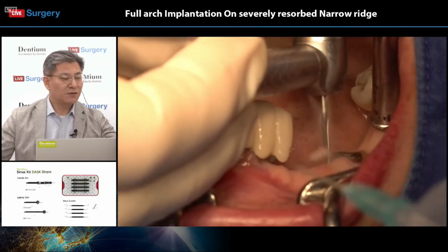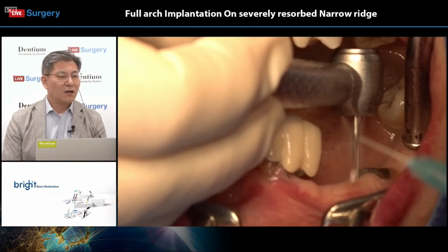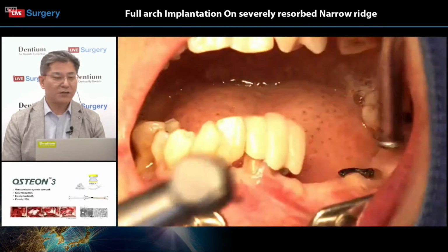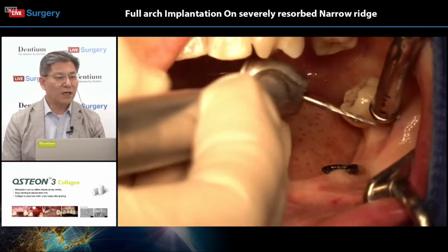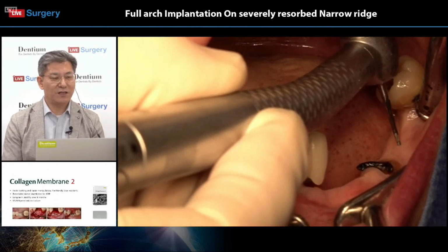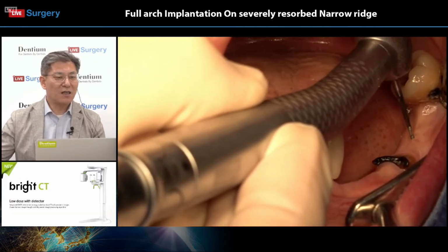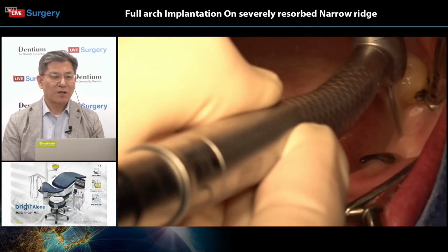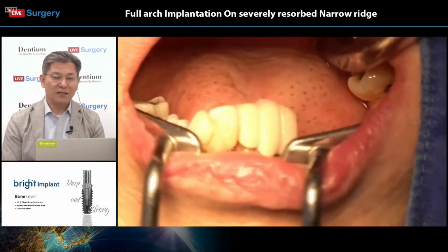Okay, so for today's surgery, Dr. Chung planned a freehand style implantation. Sometimes we can use digital guided surgery in this case, since it's a multiple and complex case. But as you know, in this kind of situation, very frequently actually, freehand style surgeries are acceptable and adaptable.